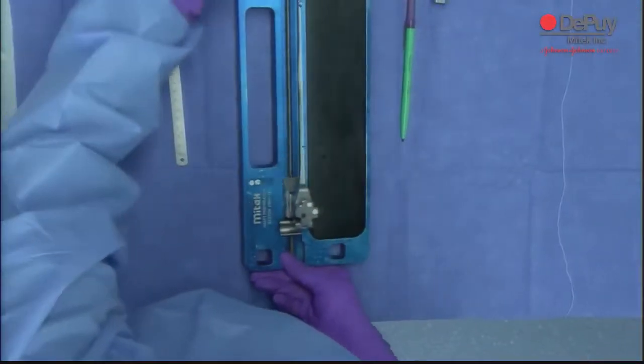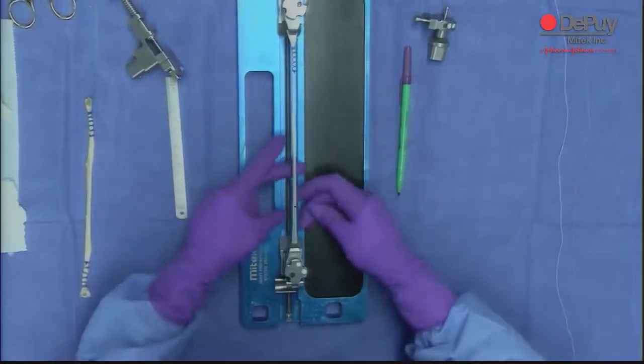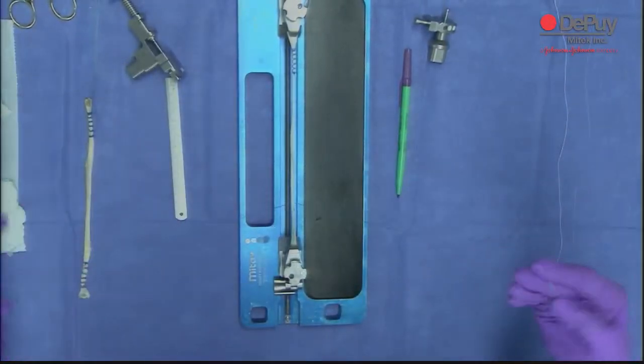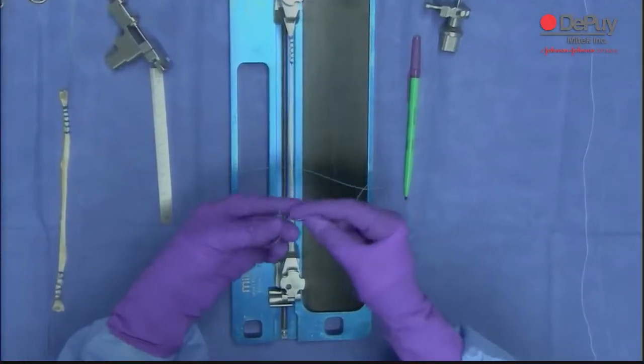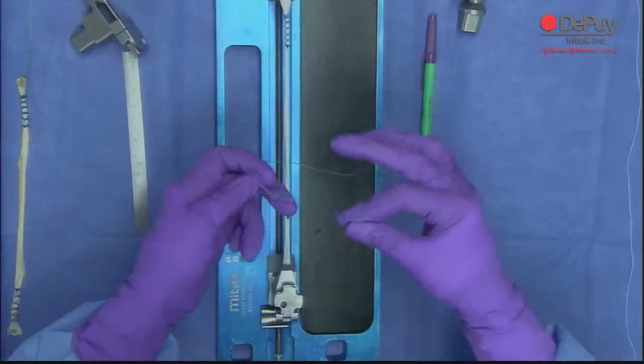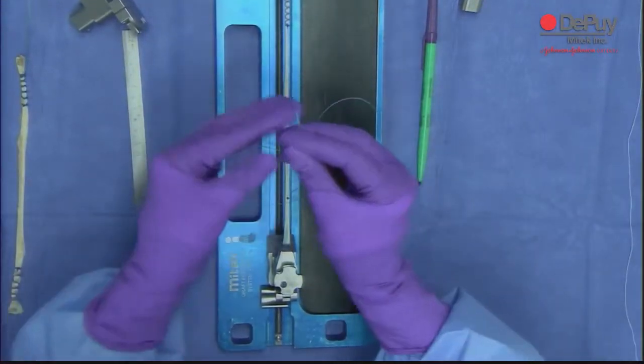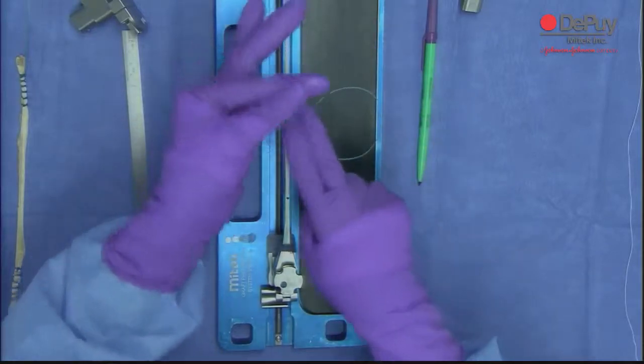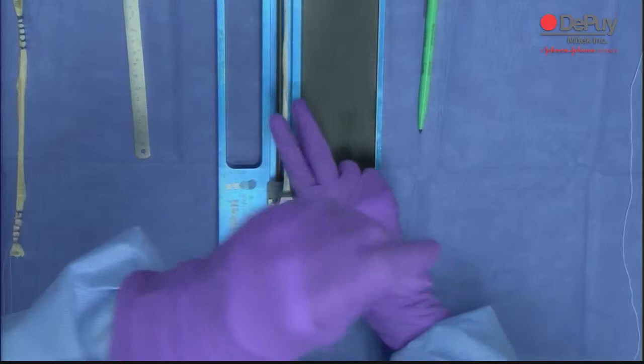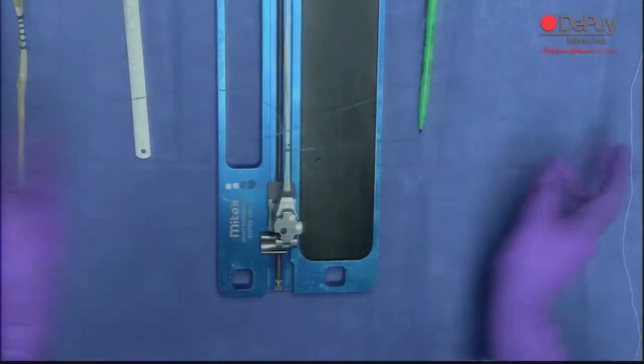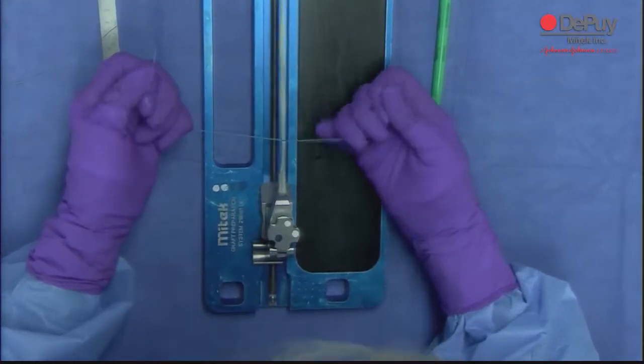We're going to do this side. This side I'm going to do with a green ethibond, number two ethibond. I'm going to do the same thing I did before, which is I make a surgeon's knot, through once, twice. I hold them together here, put my fingers in, push it down. That's just to get two equal lengths of suture. Tighten it down.